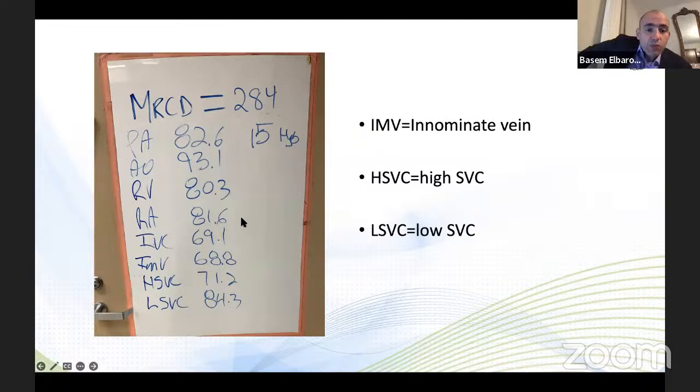Anyone want to take a guess what pathology can cause this jump in the oxygen saturation at the level of the SVC? You can write it in the chat. I'll give you guys 15 seconds to think about it, and I'll give you what the answer is.